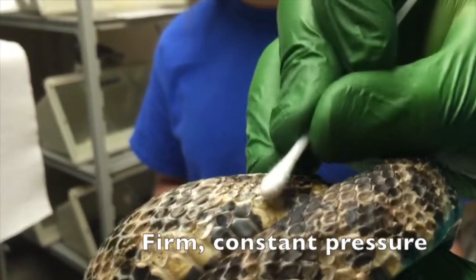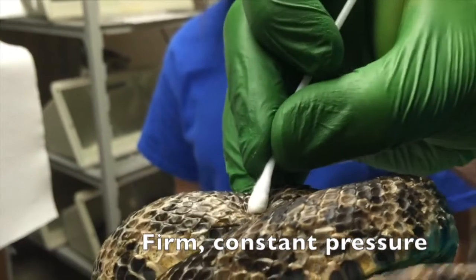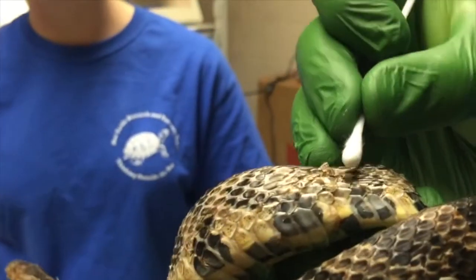After collecting all the necessary information and swabs from the snake, return the snake to the wild at the location where it was found.